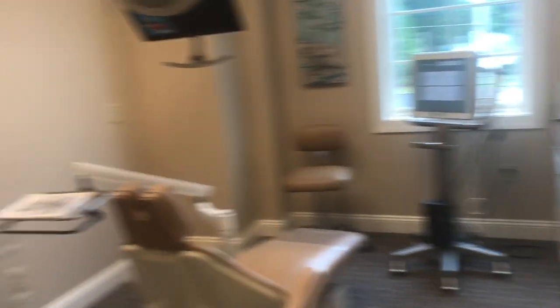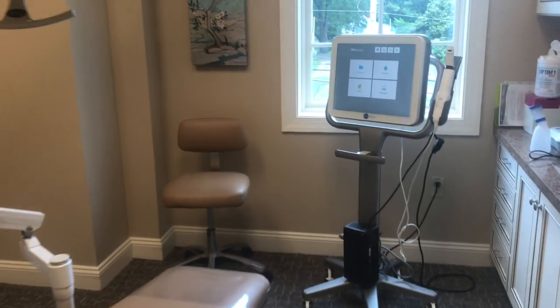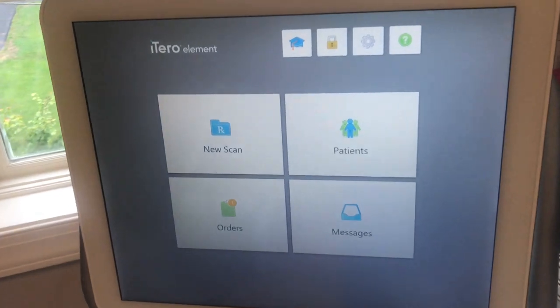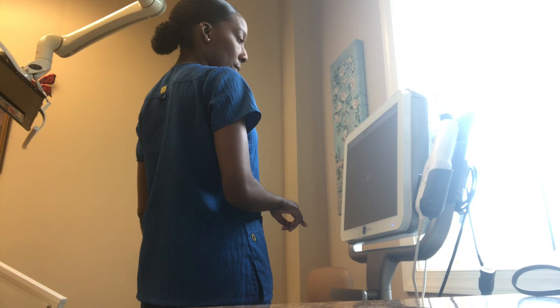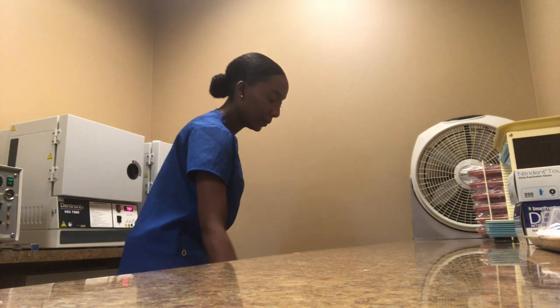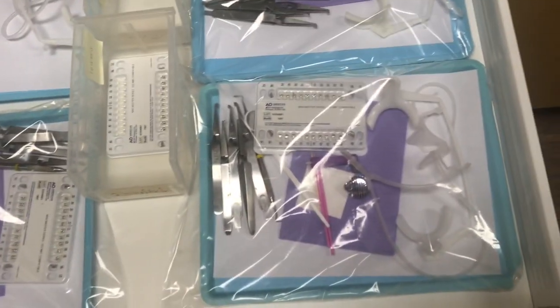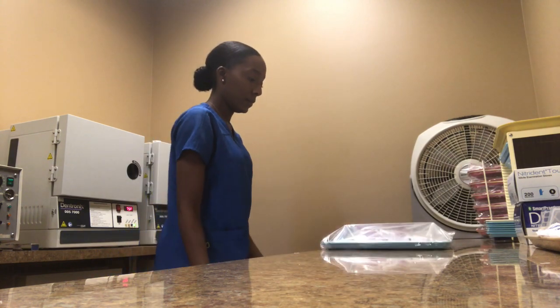Next, for our bonding appointments — which are appointments where we put on braces — typically we'll get the patients in a private treatment room. First we will take a scan with this iTero scanner, and with this scanner it develops a 3D image of the upper and lower teeth. I'm just inputting the patient's information and getting everything set up for the scan. Once I get the scan I'll go ahead and set up for the bonding. Here's where we keep all the bonding trays — I'll grab one and take it to the room.